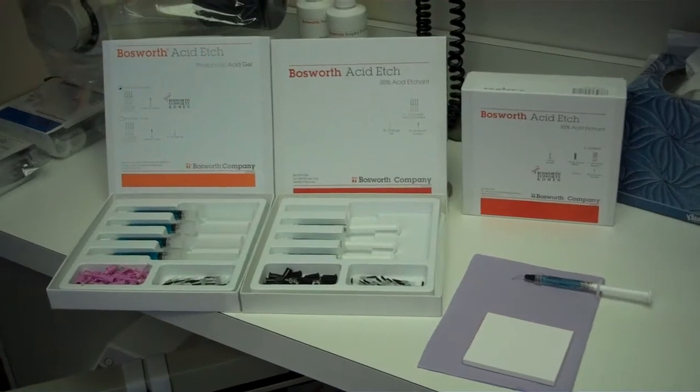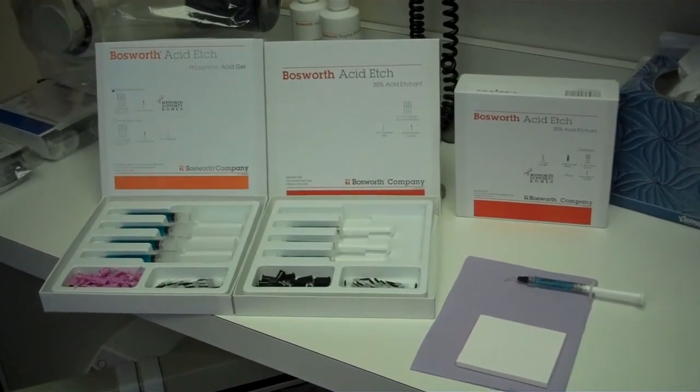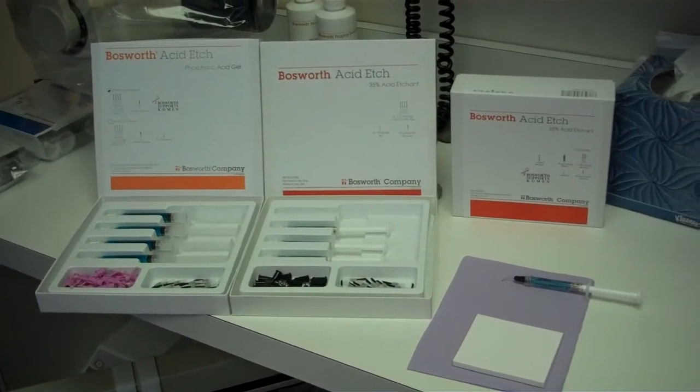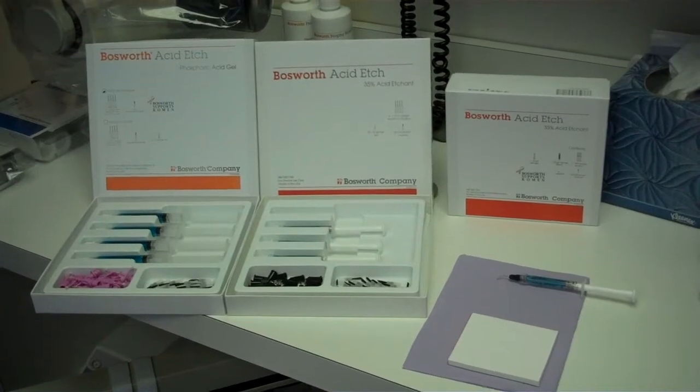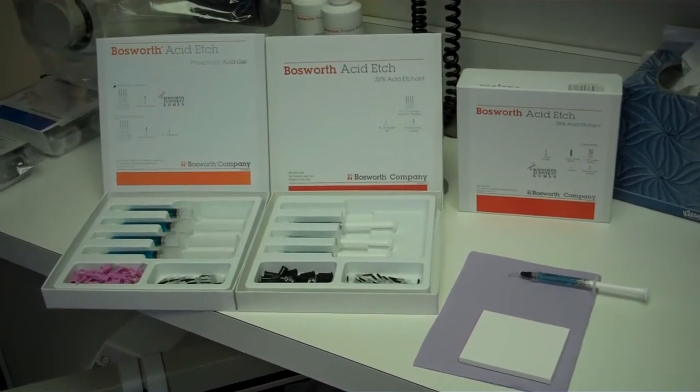Welcome to the Bosworth Company and an introduction to our 35% Acid Etch. Bosworth Acid Etch is silica and glycerin free, and therefore provides a cleaner, rougher, and increased surface area free of biofilm.